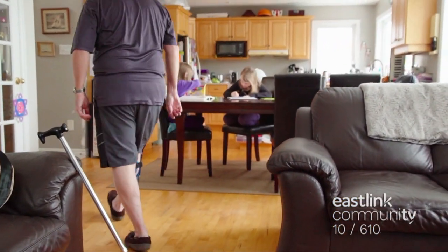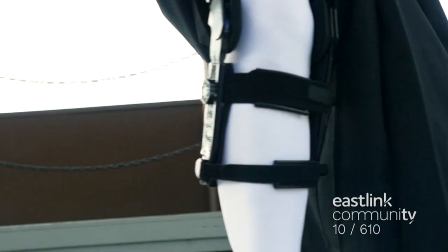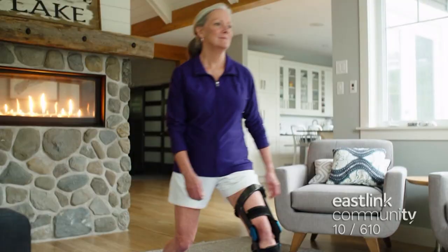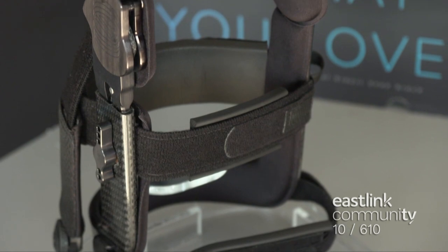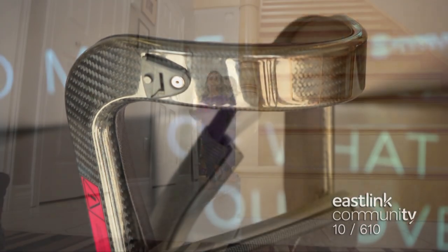The word bionic brings back thoughts of the $6 million man and his super speed and strength. But the folks at Spring Loaded Technology have created the world's first bionic knee brace that may not make you quite as fast, but it does help a whole lot of people with knee problems. This powered knee brace is designed to help reduce pain and get people who suffer with knee injuries and osteoarthritis moving.